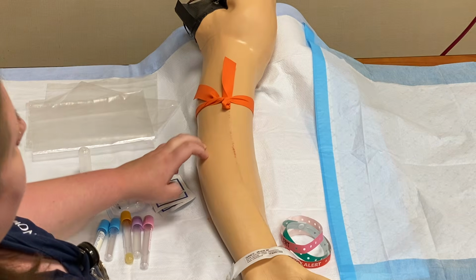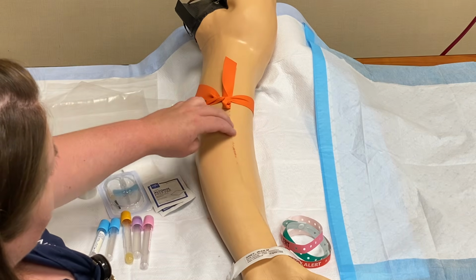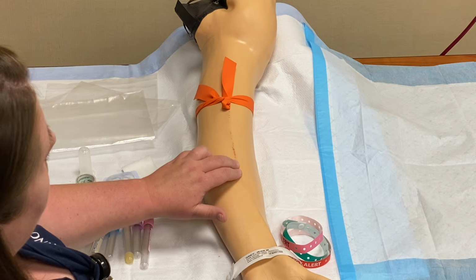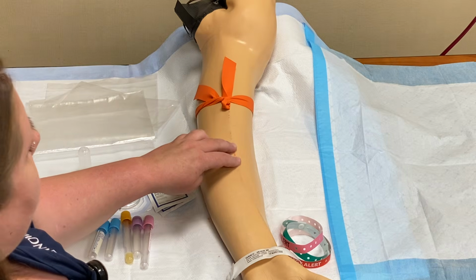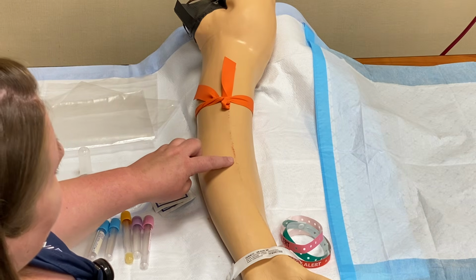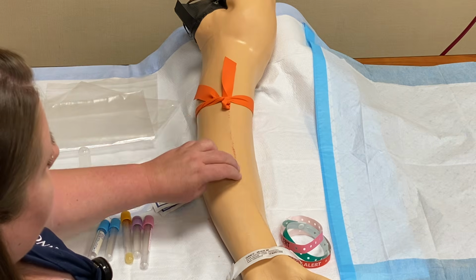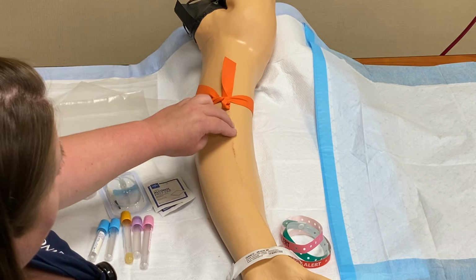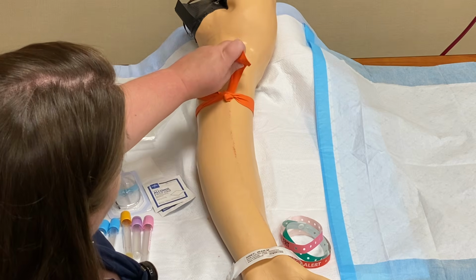So now that I have that on, I'm gonna palpate for a good vein, and I'm feeling for a soft, bouncy vein, no pulse. If I feel a pulse, it's an artery, and I don't want to use that for phlebotomy. The vein does not have to be completely straight since I'm not putting a catheter in. The straighter it is though, the easier it'll be, so if you can find one, that's great. So I found a nice, soft, bouncy vein, no pulse.